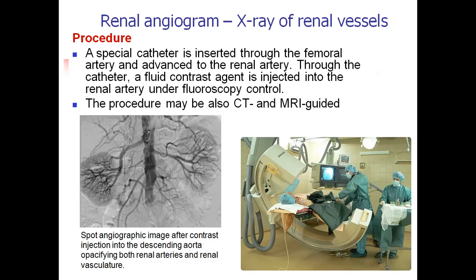The procedure also may be CT or MRI guided, but X-ray renal angiogram is simpler.